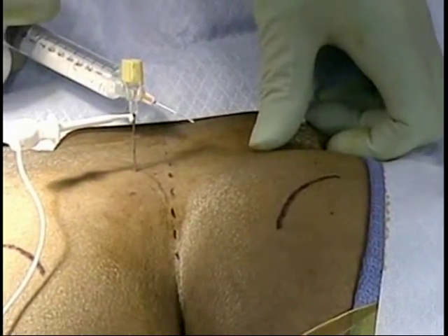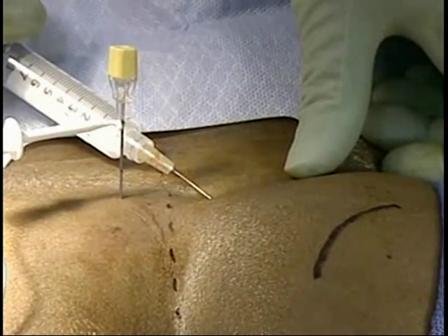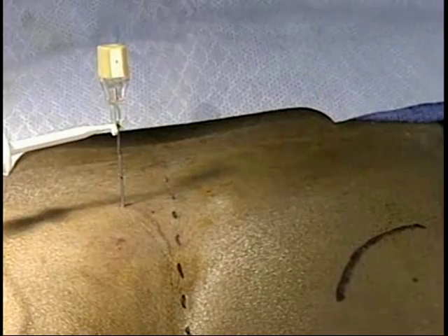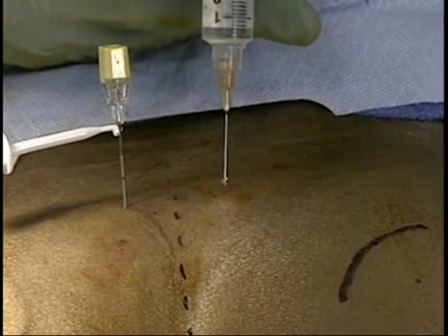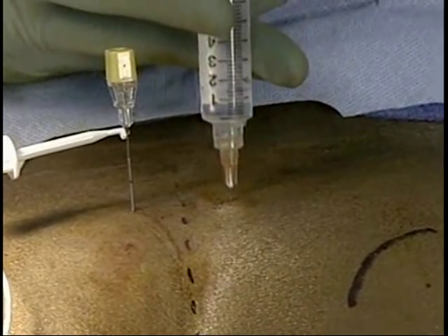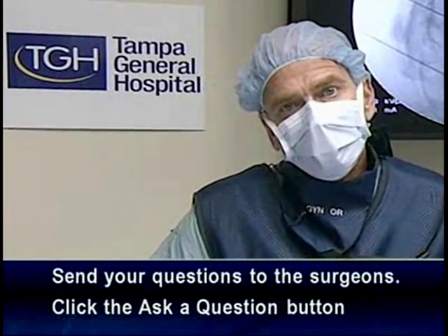I'm going to let the patient know there's going to be another poke for the anesthetic. While he's doing the numbing, I'd like to invite any more questions. We do have another one about whether alcohol or medication affects the device.